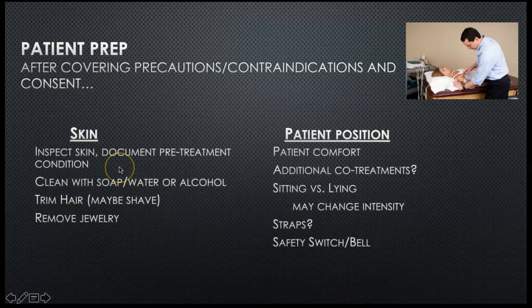You want to take note of how their skin looked before the treatment, because it might look different after the treatment, and if there is a difference, you need to know what it looked like before. So you look at it, and you document it.